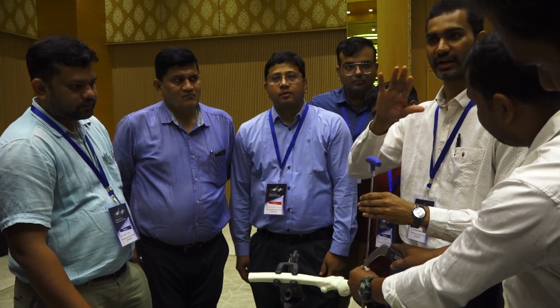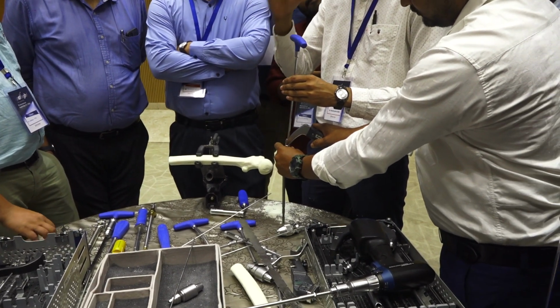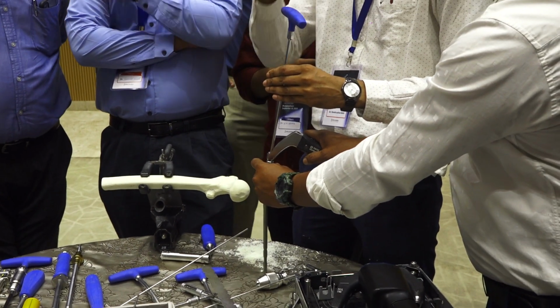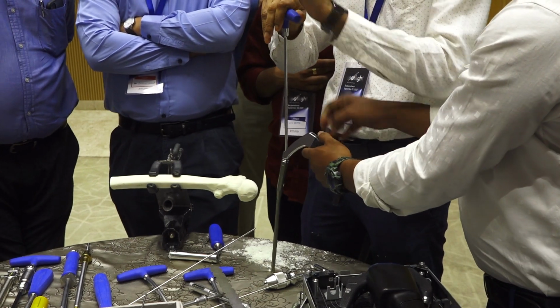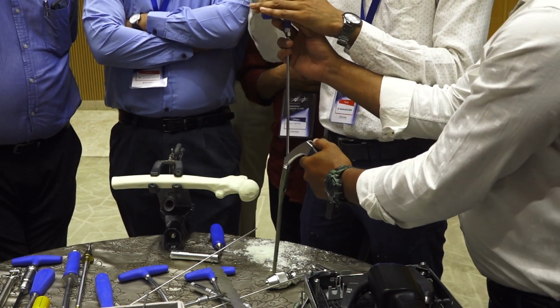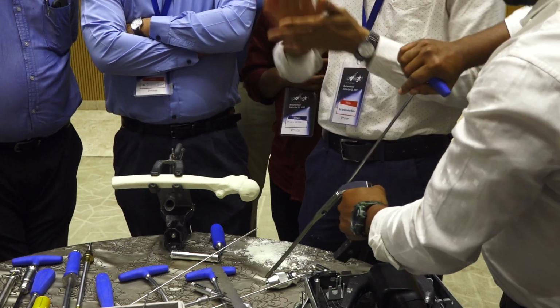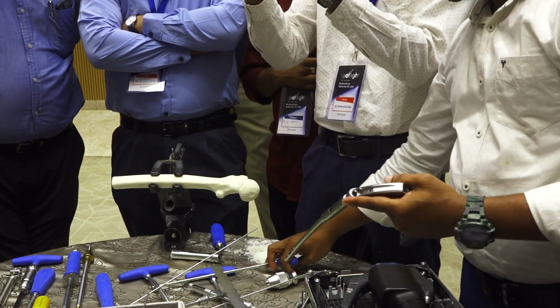In a standard PFN, there is a chance of cutout if you are going a little bit lower and purchasing the good bone, it is okay. But in TFNA, they are saying that even if it is center, because of the helical blade design, whenever you hammer it, it will get compacted. And if you are doing cement augmentation also, center part is better to fill the canal.